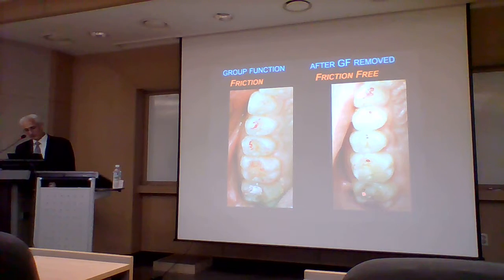Although you can see there's a line right there, very short line. So it's very difficult actually to treat the disclusion time down to zero. There's always some friction that remains. The goal is to make it as short as possible.